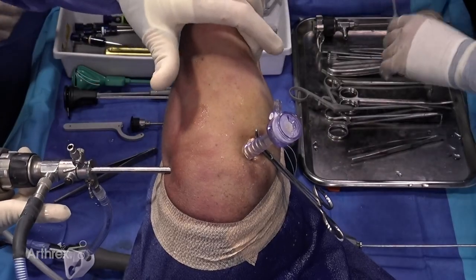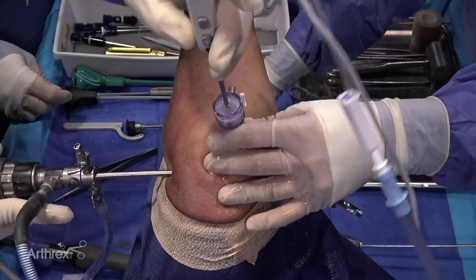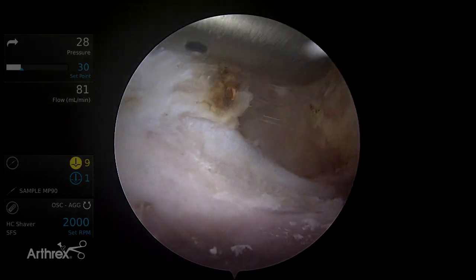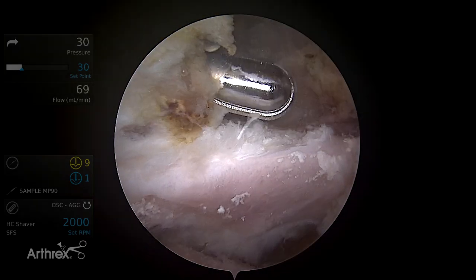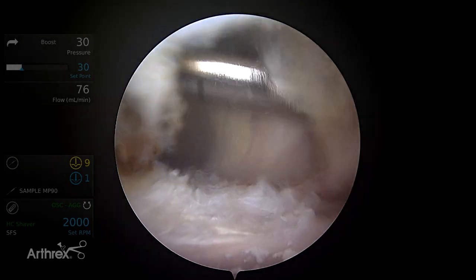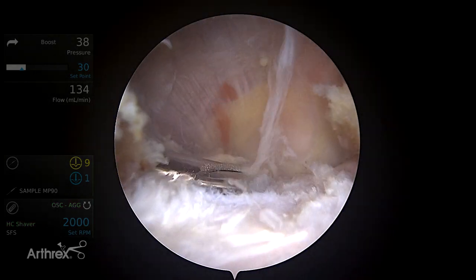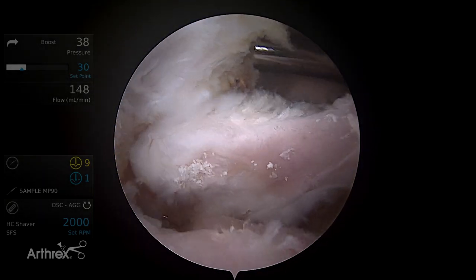The next step is to open the rotator interval and clear the subcoracoid space so that we can assess it and create a space for placement of our medial anchor. It's easiest to first do this with a cautery, feeling for the coracoid anteriorly. Once that space is cleared, redirect a shaver anterior to the comma tissue. I can use a posterior lever push to provide a little more room. Once I've accessed that space, it's advantageous to move to a 70-degree scope, which provides a better aerial view down the subscapularis tendon.